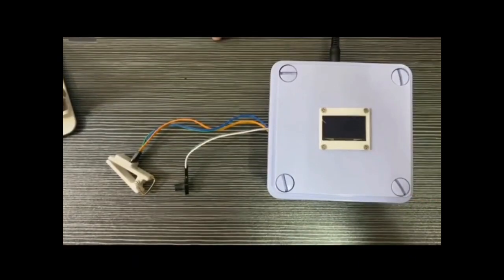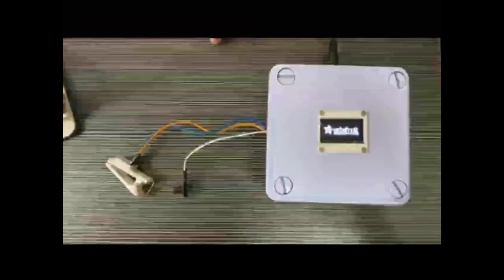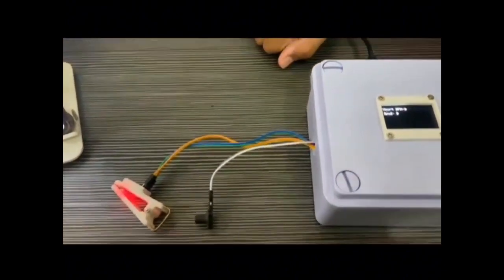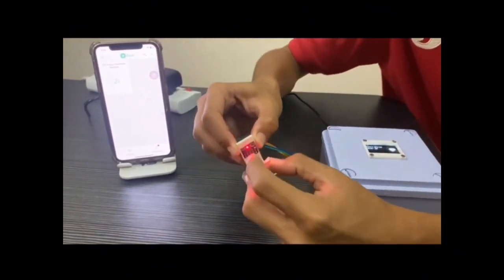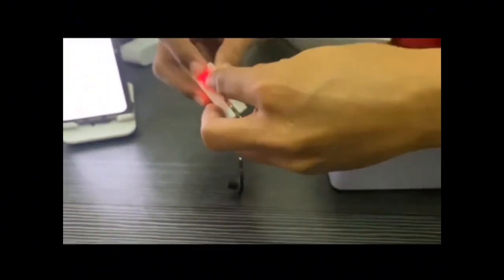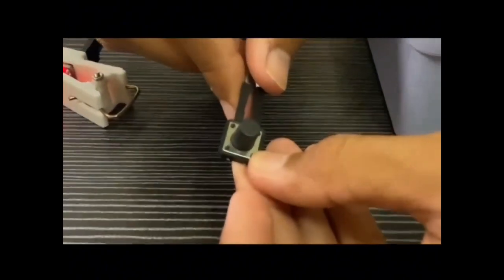Next, I will demonstrate the project. First, turn on the switch and make sure the Wi-Fi or hotspot is active. Once the ESP is connected to the Wi-Fi, it will power up both the LCD and the oximeter sensor. Here, the 3D printed fingertip holder is designed to secure the sensor and fingertip together. This is the push button for the emergency notification.